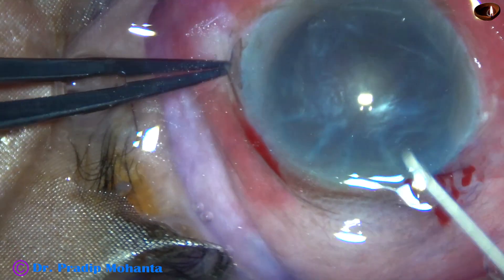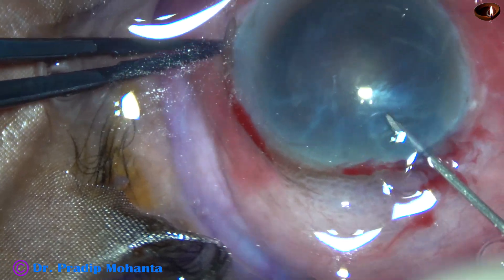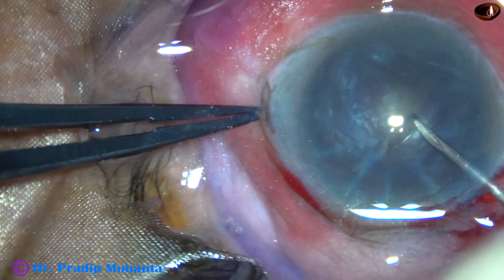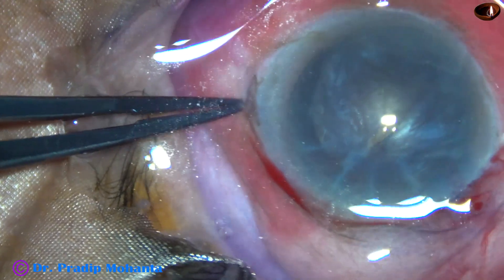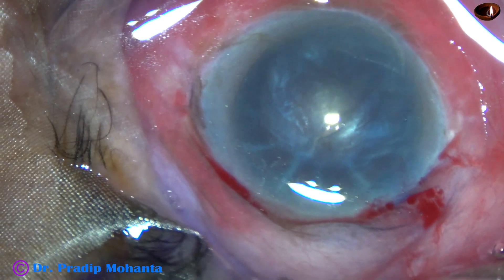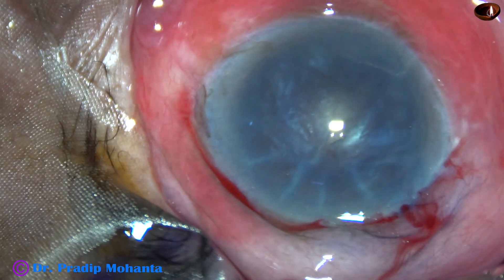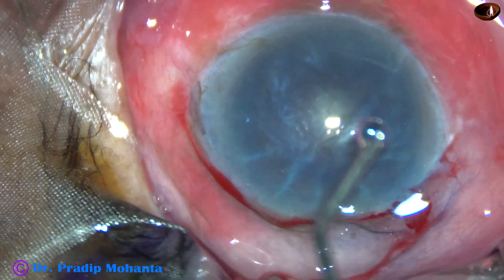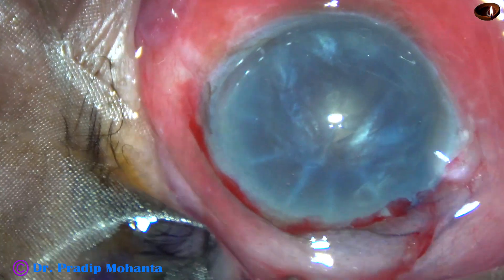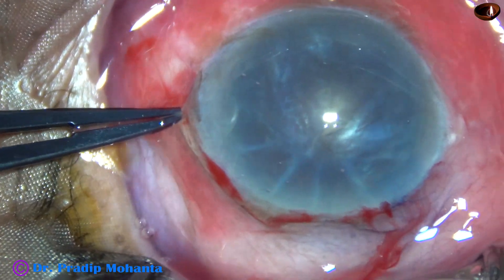Now is the time to do capsulorhexis. I have taken a 26-gauge bent needle cystotome. I am going to incise — here it is — I have incised the anterior capsule and raised a capsular tag. And now, to improve the visibility, I am going to apply some visco over the corneal epithelium. This is 2% hydroxypropyl methyl cellulose, and the visibility improves a lot.